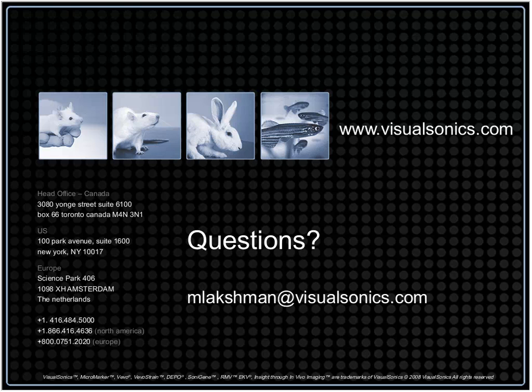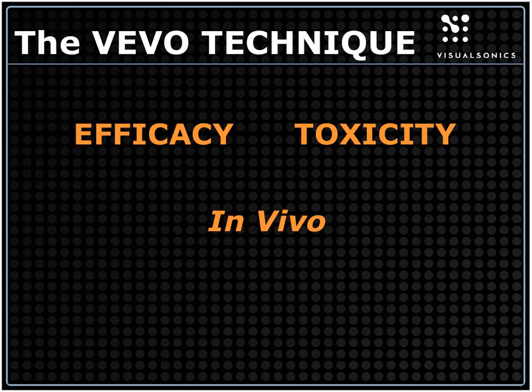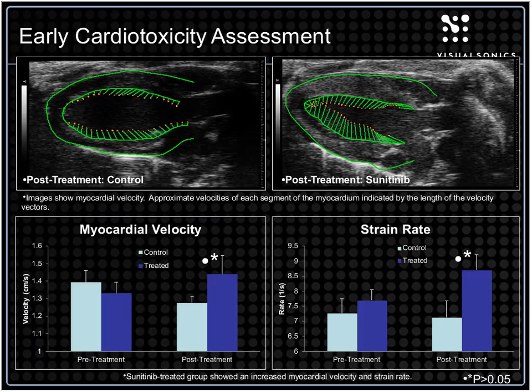Okay, I'll take the second part, the vascular, looking at molecular markers of molecular expression using targeted contrast enhanced ultrasound. Yeah, that can be done, and actually I quickly went over the table that I provided in the webinar on molecular imaging and whether they can be used as markers. The answer is still undergoing, but using targeted contrast enhanced ultrasound imaging, yes, you can look at those markers, so it will be non-invasive.